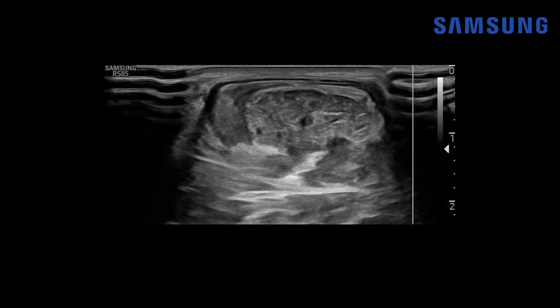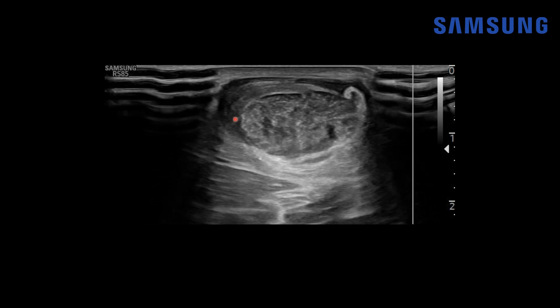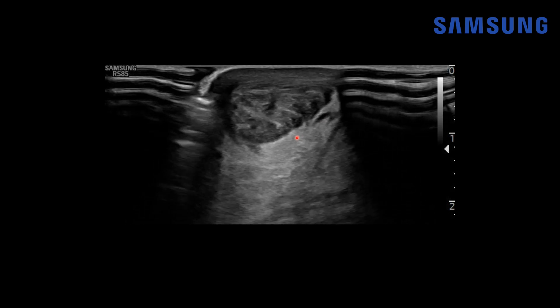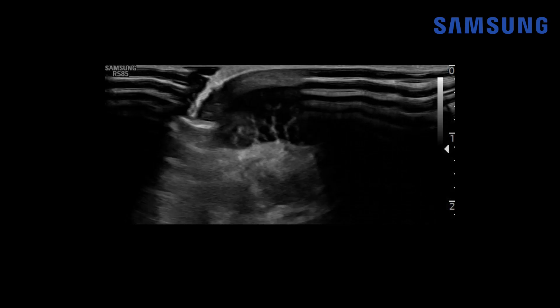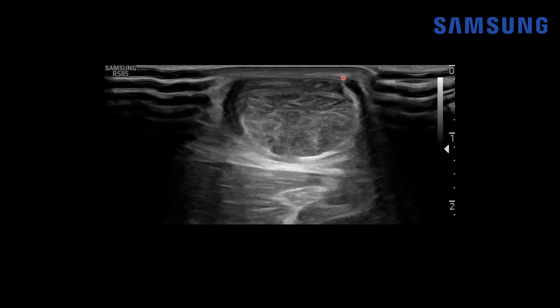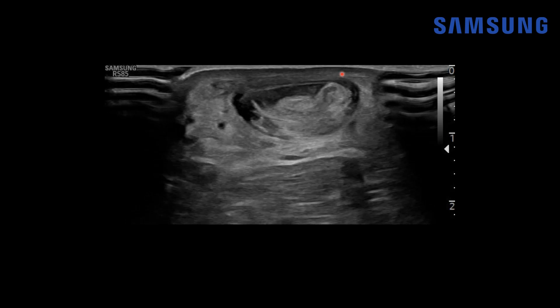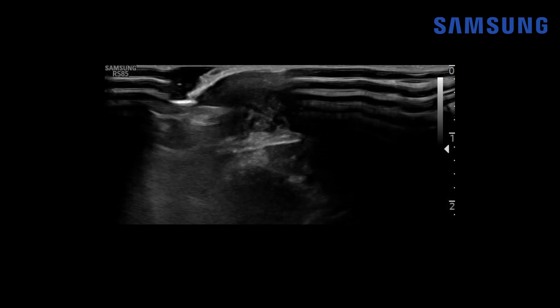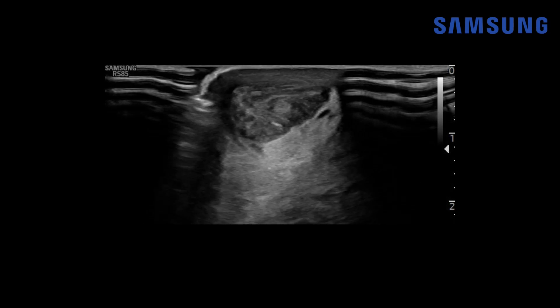On transverse real-time imaging moving superior to inferior, notice this hypoechoic rind surrounding the Achilles tendon — that's the inflamed peritenon. We then see the full thickness tear with echogenic material and tendon disruption. Also notice this small rounded echogenic focus at the medial aspect of the Achilles tendon — that's the plantaris tendon, which we sometimes see particularly in the setting of full thickness tears at the medial aspect of the tendon.